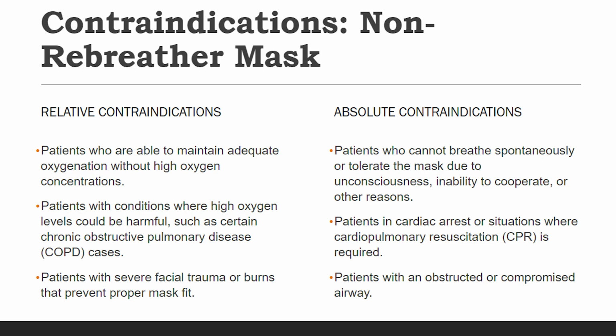In situations where cardiopulmonary resuscitation, or CPR, is required, the non-rebreather mask is typically not used, as it may interfere with the resuscitation efforts. Patients with obstructed or compromised airway should not receive oxygen through a non-rebreather mask, as it may impede efforts to clear the airway. Being aware of these contraindications is essential for healthcare providers to make informed decisions about oxygen administration and ensure patient safety.